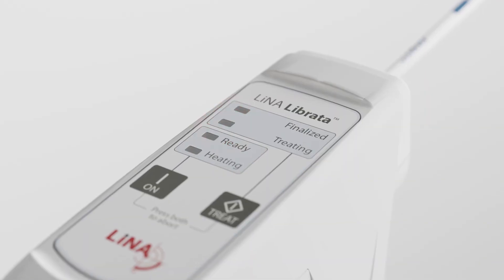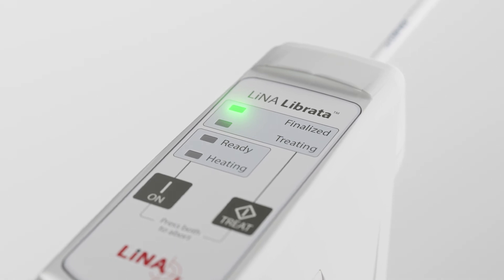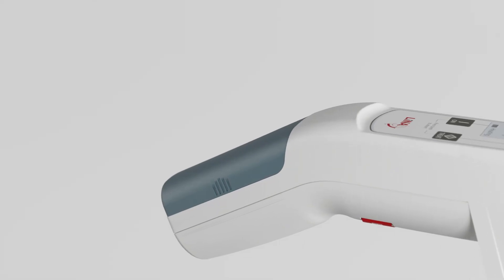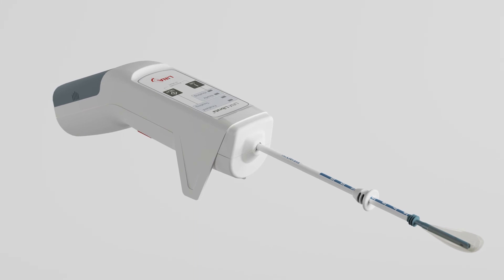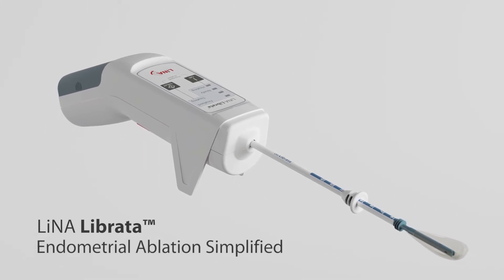At the end of the fifth cycle, the finalized light will illuminate, indicating that all fluid has been removed from the balloon and the catheter may now be withdrawn. Remove the battery from the device and dispose of each accordingly. Lina Librata — Endometrial Ablation Simplified.